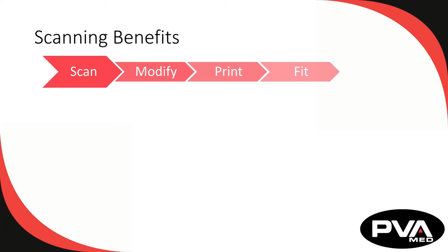Now let's dive in and cover some of the benefits of the scanning step in the digital workflow. Scanning is quick and easy to perform. Think of going to your primary care physician's office and the natural course of that visit. Each time we go, the information collected includes height and weight at the beginning of that visit. It's easy to collect, documents changes over time, and is added to your medical record.